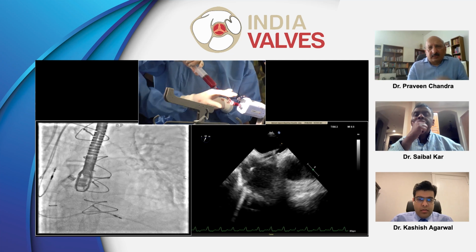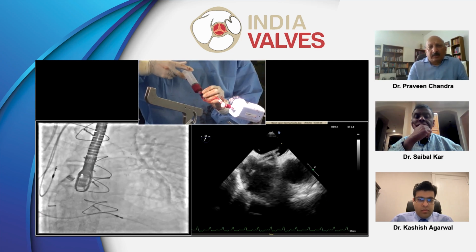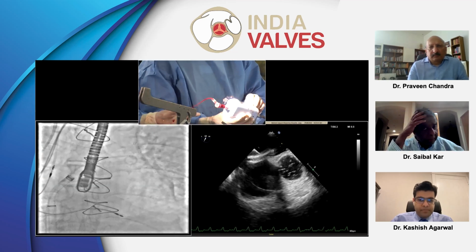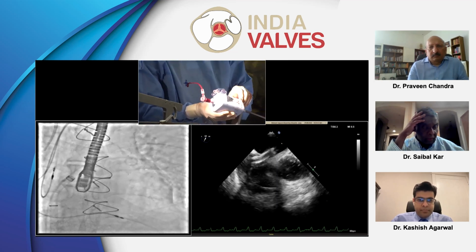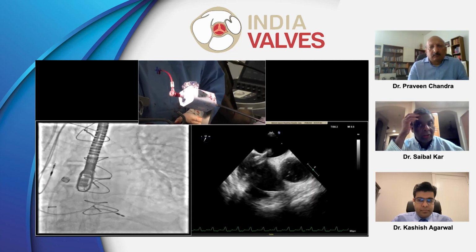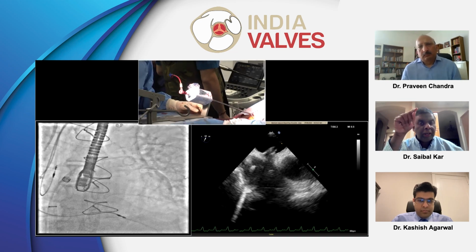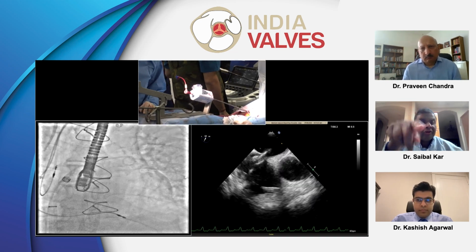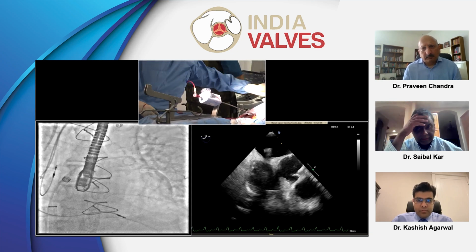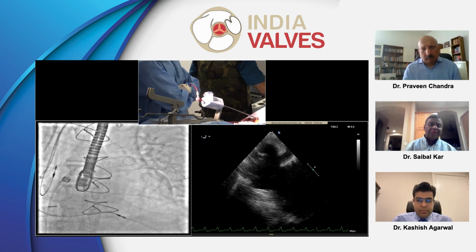Are there any instances when air gets sucked in? And can you tell everybody about how to prevent that air embolism? This is a very important aspect of the procedure: when you're putting the guide in, make sure that the guide is not touching the wall. Because if it touches the wall, you can cause a suction and you can get air entrained from the hub. So you make sure that you can clearly see the guide. And then if you aspirate gently and you're still seeing blood, you're fine. So that's how you prevent it.